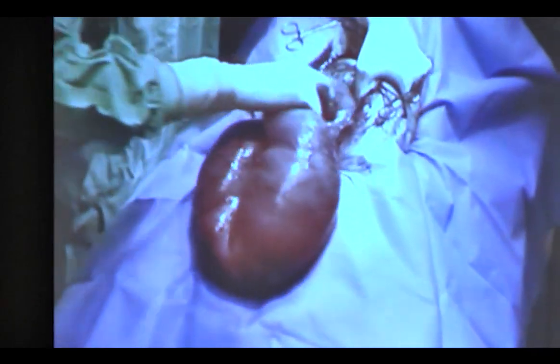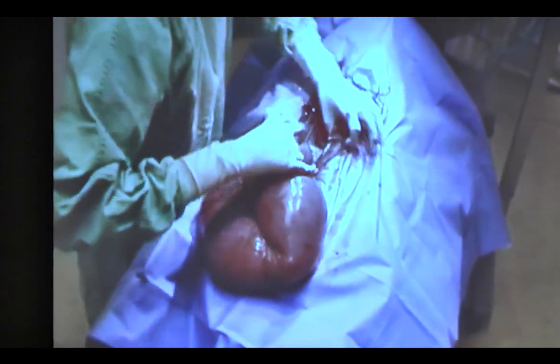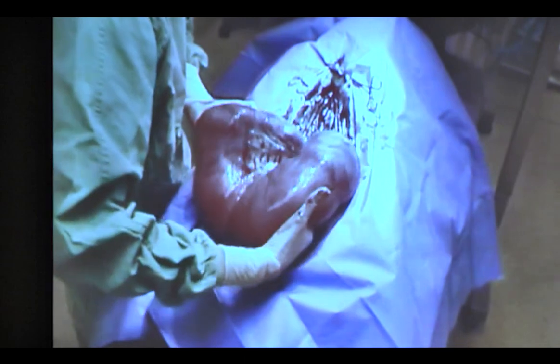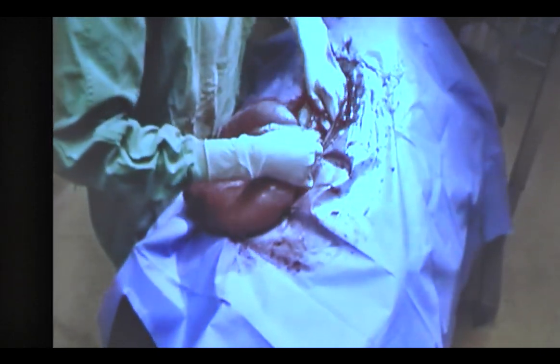And these puppies are big. But wait, there's more. You can see how she just took off an adhesion? This bitch had a previous C-section. So you have to turn it around and figure out which one it is. This is what makes it so fun.